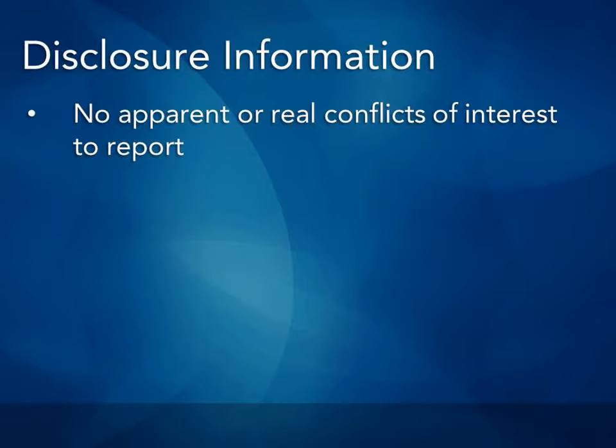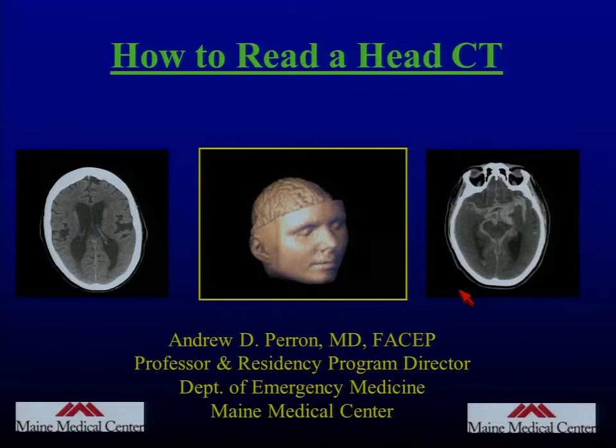All right, thanks. This is a good early on the first day kind of talk. A lot of pattern recognition. This is a lot of stuff everybody knows, but it's nice to review. No formulas will be calculated, which is always useful early on the first day.